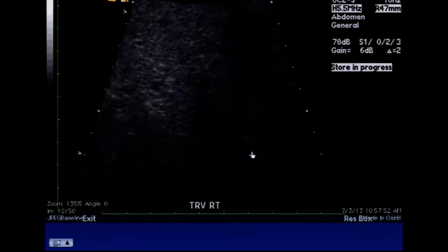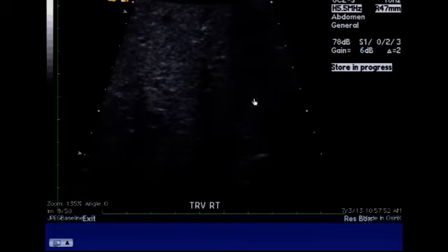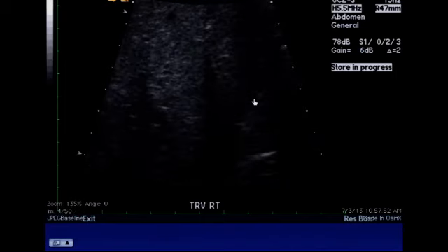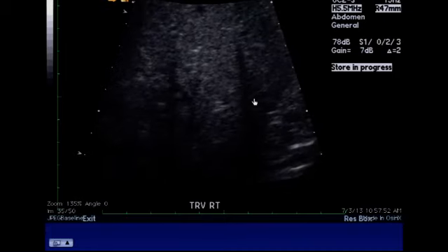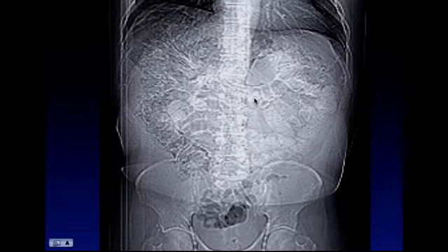When we looked at the venous outflow, namely here the hepatic veins, we see these same little high density foci moving through, indicating that these gas bubbles had moved completely through his hepatic circulation and were now circulating back to the hepatic vein. Because the patient was minimally symptomatic, he was allowed to go home after consultation with the physician, and came back 2 days later just to confirm our suspicion, which was that this patient had pneumatosis, and we just happened to catch the air as it was passing through the portal venous system.